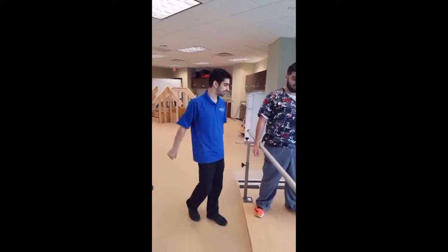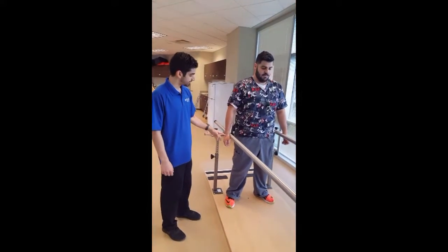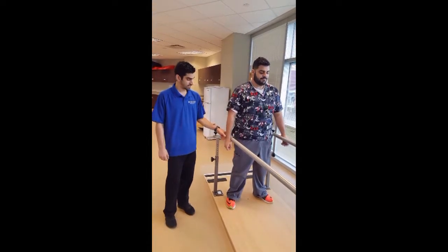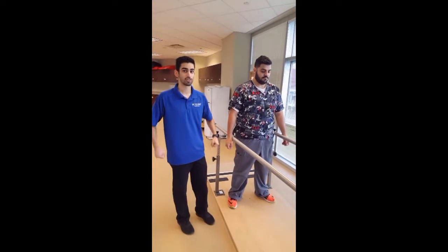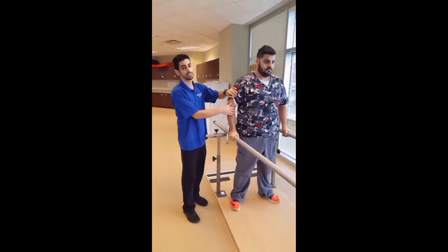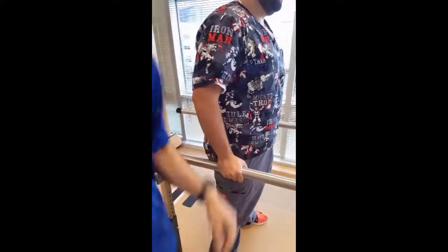For the parallel bars, you want to make sure, with the same general rule as before, that the bars are at his ulnar styloid. Put your hands down. And then also that the bars are shoulder width apart. And you also want to make sure that the angle at the elbow is 20 to 30 degrees. That's going to be the same thing with all the other assistive devices as well.